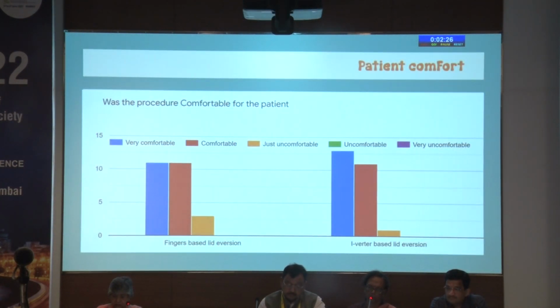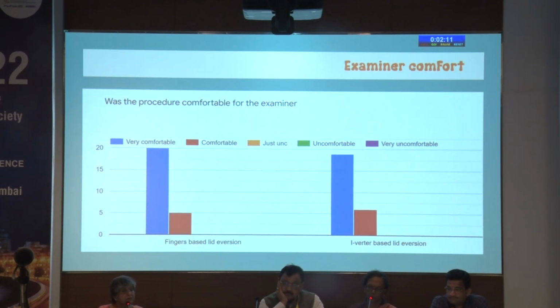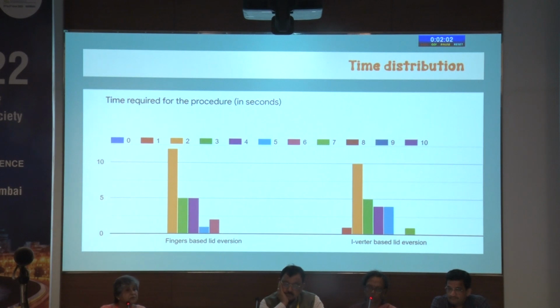So the results showed that the iVerter was a little more comfortable for the patient compared to the finger-based lid eversion. It was shown that finger-based lid eversion experienced little to mild pain, while iVerter mostly was no pain. The examiner preferred both the techniques equally. The time required was a little more for the finger-based lid eversion.